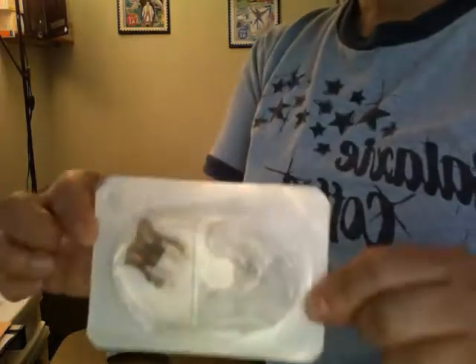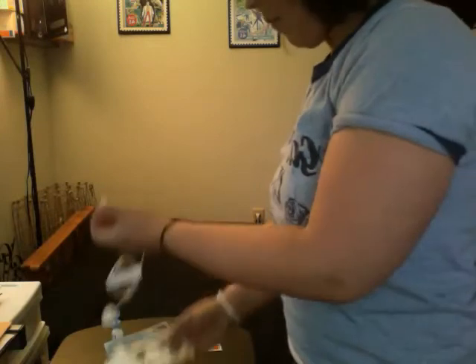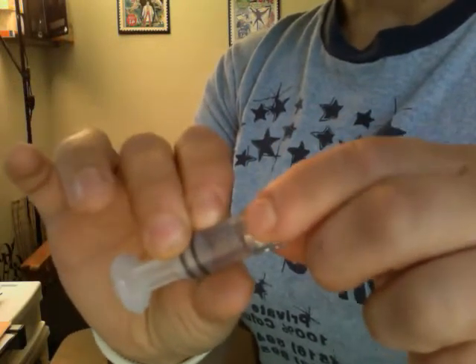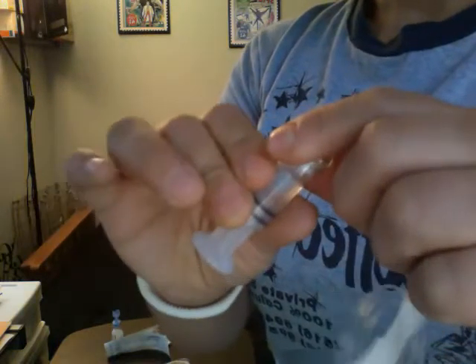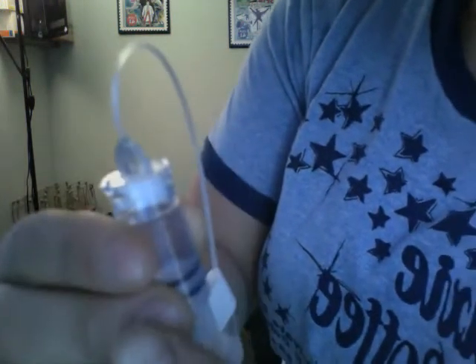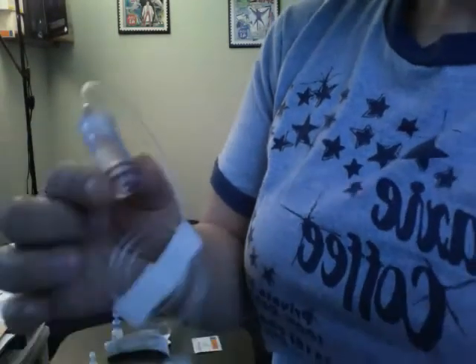and now I open my infusion set. Take my tubing, put the cap on here. There's like little notches, and you'll feel it fit right in if you push. Twist it till I hear that snap. I'm going to push a little bit through until I see it in the tubing. And that's just to make sure that everything is working properly and that this device, which pushes the insulin up, is functioning.